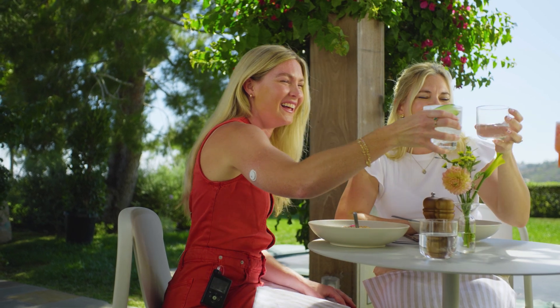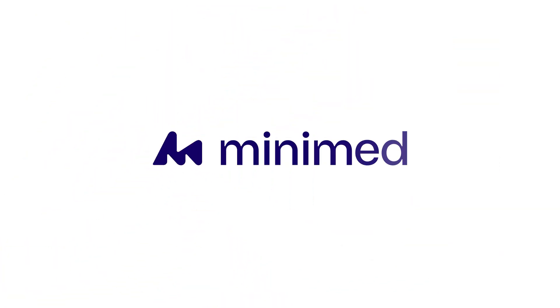That's it. Your sensor is ready and we're here to support you every step of the way.